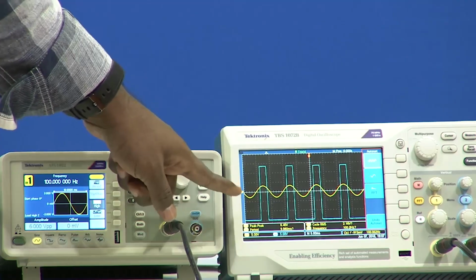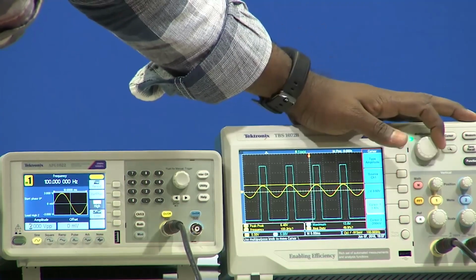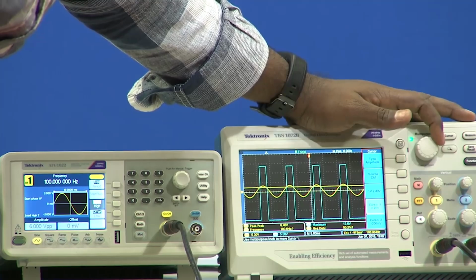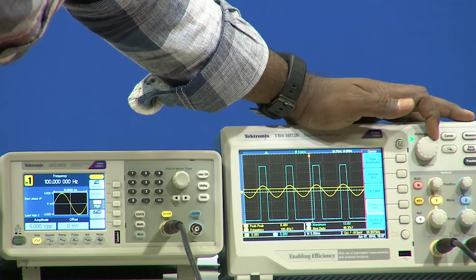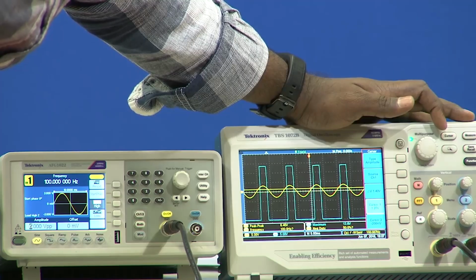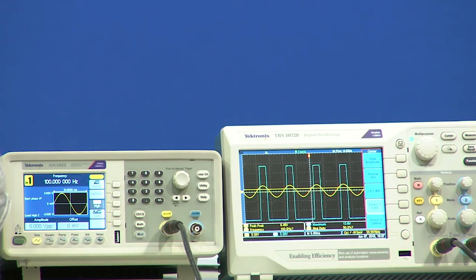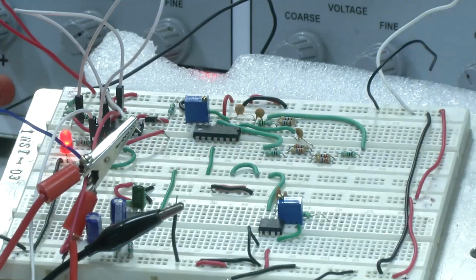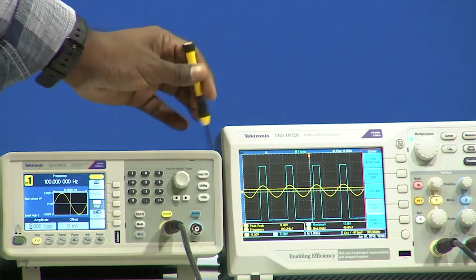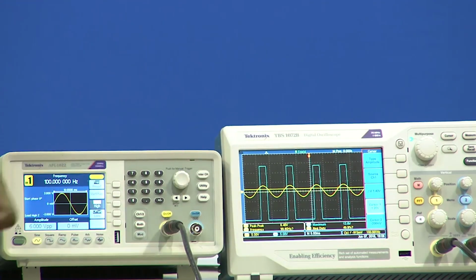Now, when we observe that, if I take a cursor of amplitude type and keep it somewhere at 1.2, that is what we are getting practically when we measure. Now, I place the cursor at that point. When you look into the CRO, this particular cursor, consider it as the threshold for ours, whatever we have calculated practically.